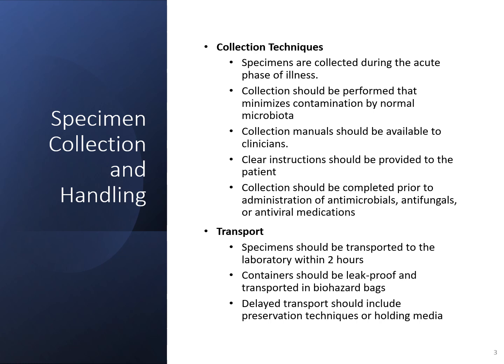So you want to make sure that you stick to just the area where you're looking for the infectious organism. You should have collection material available to those that are collecting it, as well as specific instructions for the particular type of collection that is being performed.